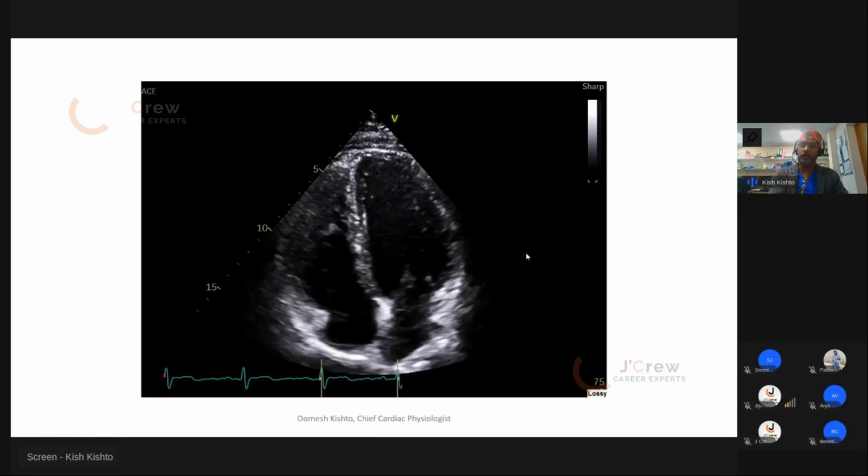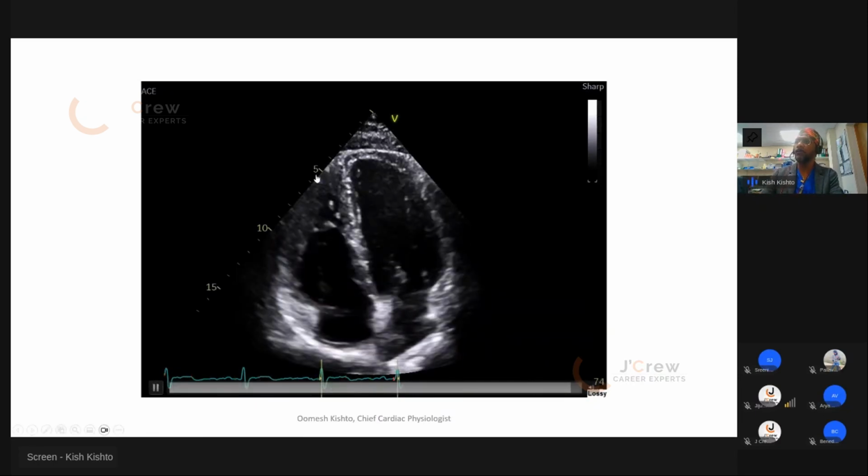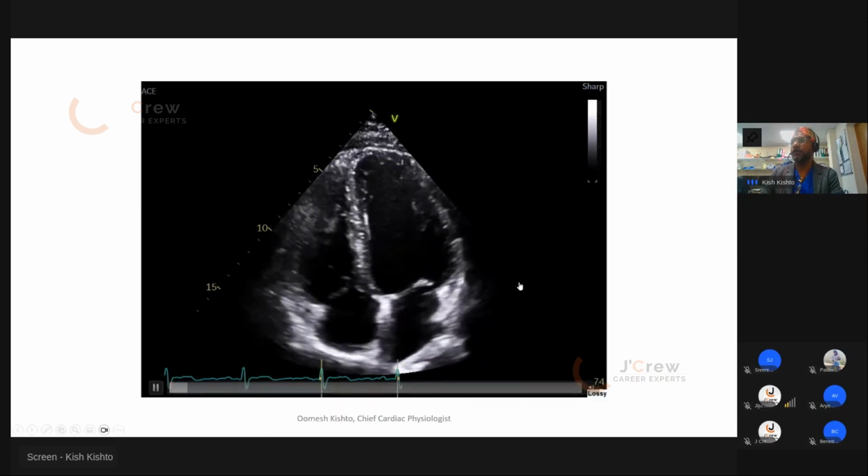So we go around, just look at the apical segment again. For apical, make sure you have all four chambers and the septum perpendicular to your probe. That could be a very small movement of the probe. So once you locate your location, it's just the tail that you need to move, not the whole probe, okay? And it's just very small movements.